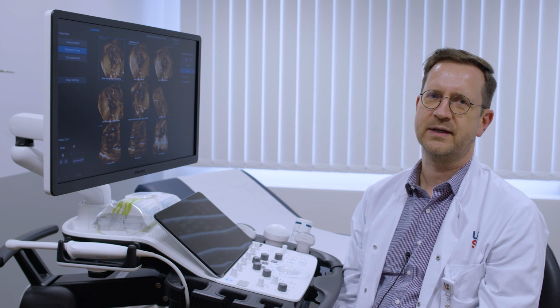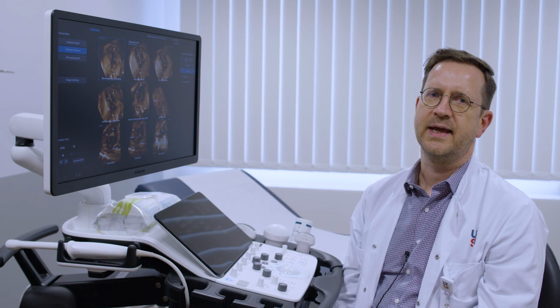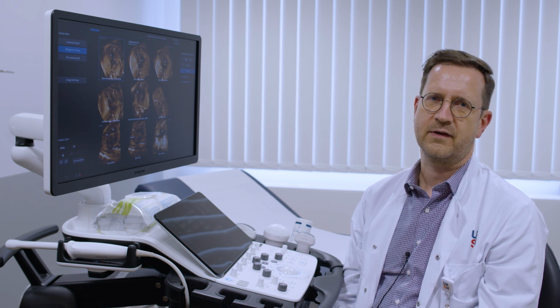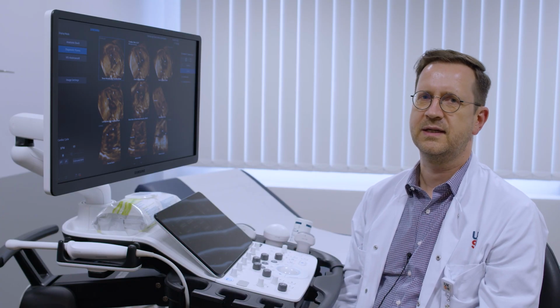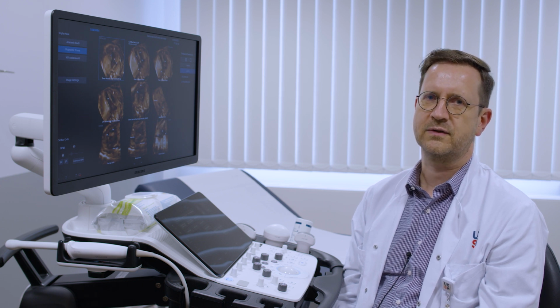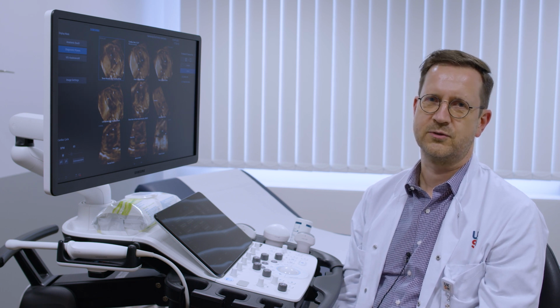What we're going to talk about today is the biometric assistance and automatic assessment of biometric parameters. We further focus on the assessment of cardiac structures, either in B mode ultrasound or in color Doppler ultrasound, and finally we will apply a semi-automatic technique, the 5T heart technique, to automatically reconstruct cardiac structures. This is what we're going to do today.